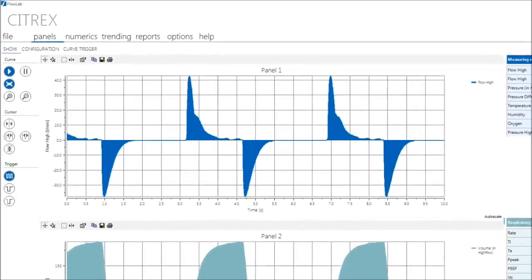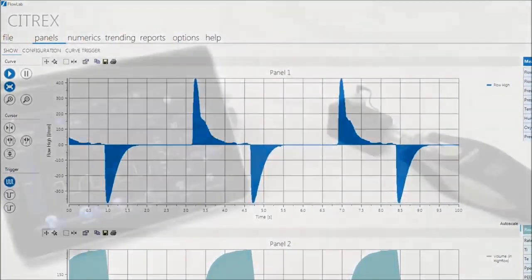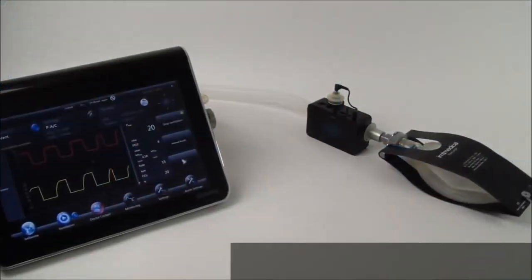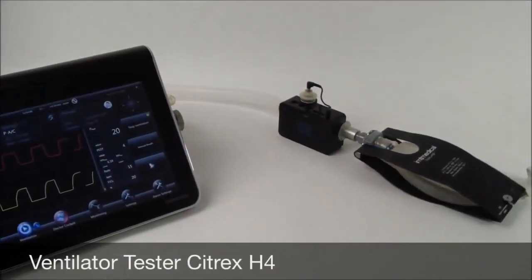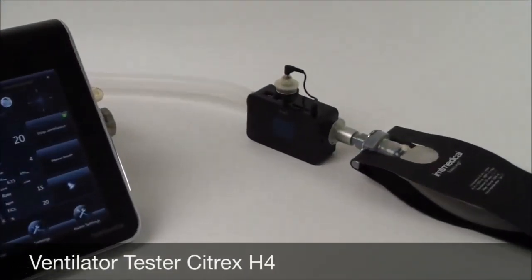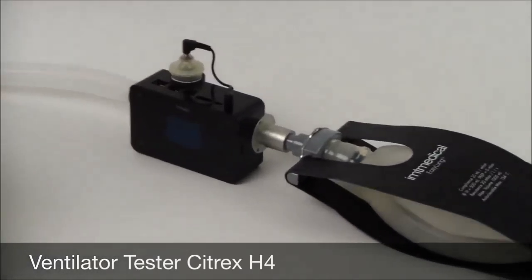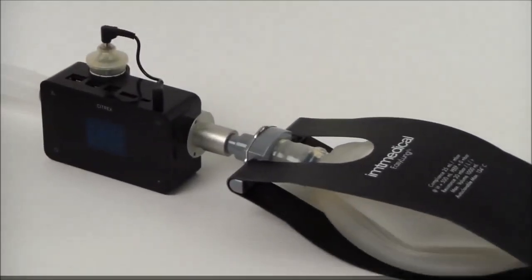The tool provides real-time curves, breath-based parameters, trending, and powerful reporting functions.